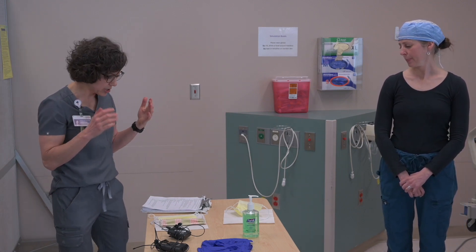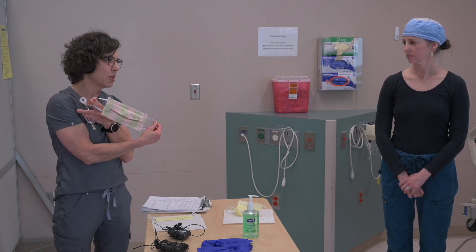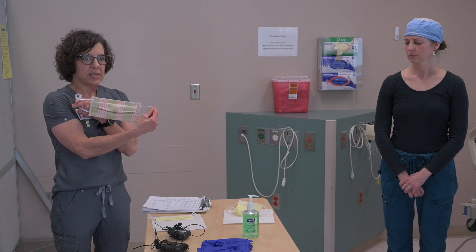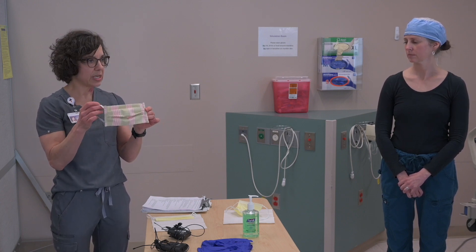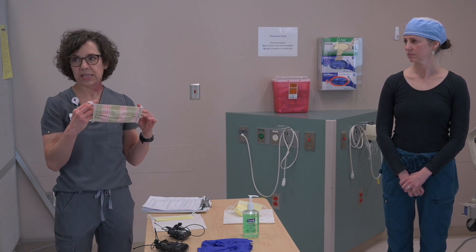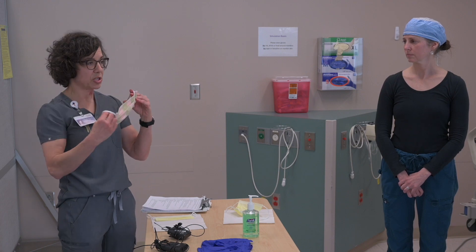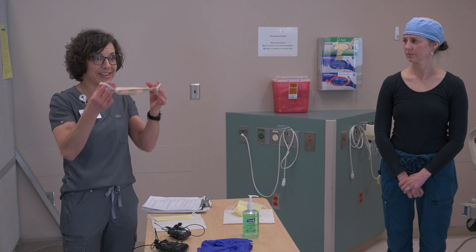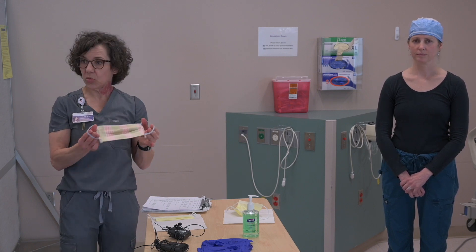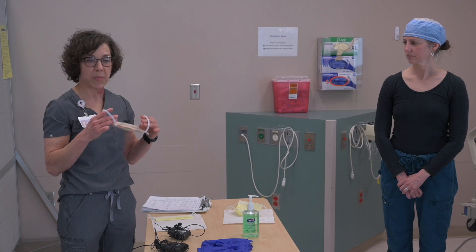So first I want to go through three different masks. This is a cloth mask — this is my personal cloth mask from home. This is very similar to what people are using when they go to the grocery store when it's difficult to maintain that six-foot social distancing. People in the hospital are allowed to wear these, but just not in patient care isolation areas, so we do have people walking through the hospital wearing their own personal masks.